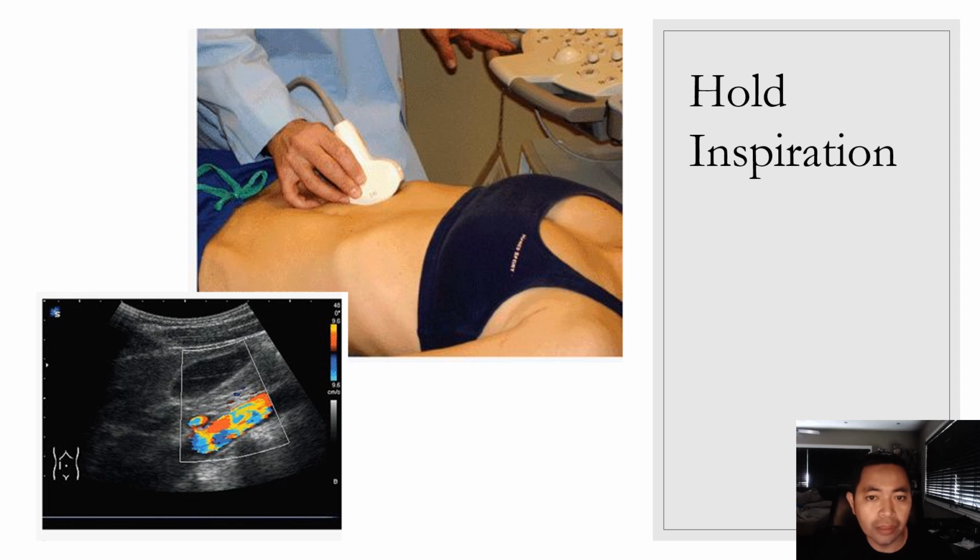To help in bringing down a high-set gallbladder, one may ask the patient to hold inspiration for a few seconds. This may be done or repeated several times as needed. Overall, with this initial approach, the gallbladder in most patients would be imaged properly already.